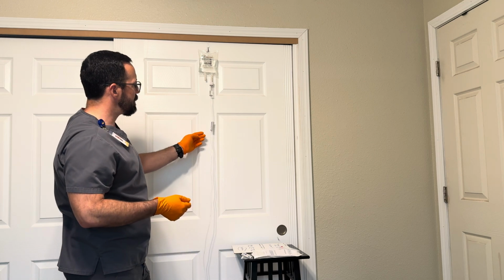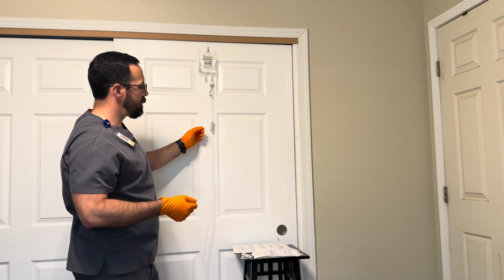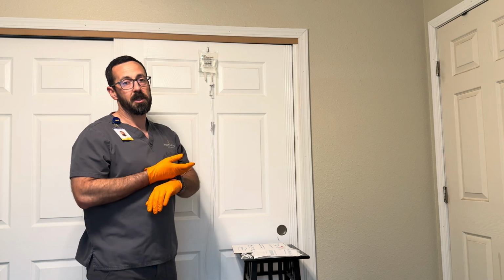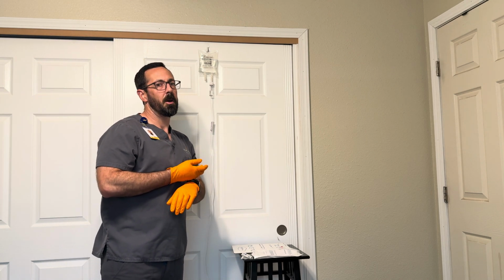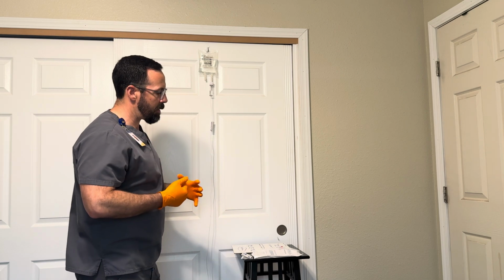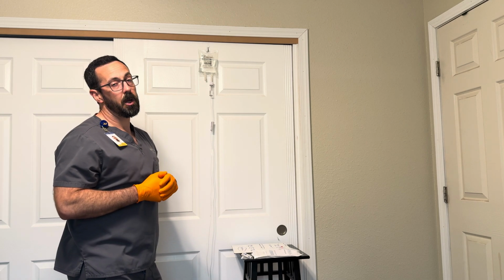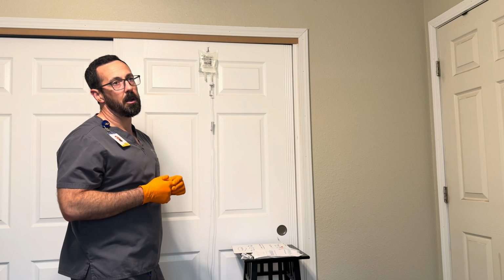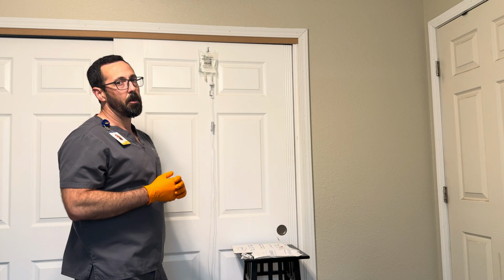The way I'm going to do this is I'm going to know my drop rate from my mouth. I'm going to open the clamp, and then I'm going to count for a full 60 seconds. If I need to adjust it, I'm going to adjust it and then go for another full 60 seconds. Knowing that my drop rate is 38 drops a minute, I'm going to be looking for a little bit faster than a drop every 2 seconds. I'm going to be looking for a drop every second and a half.